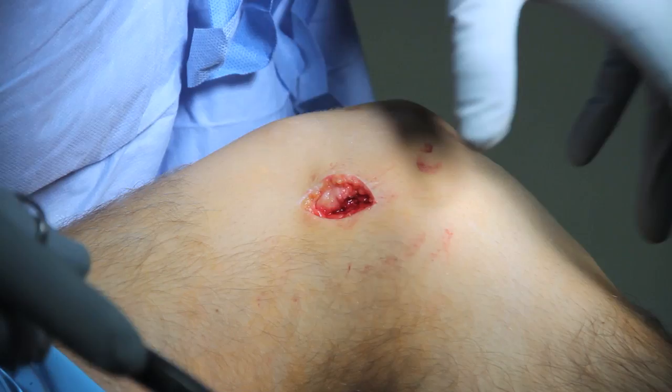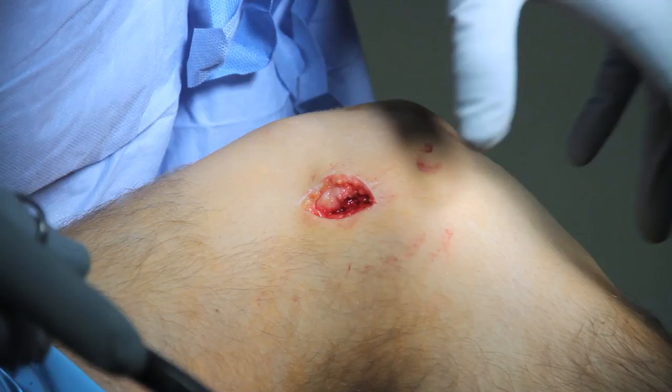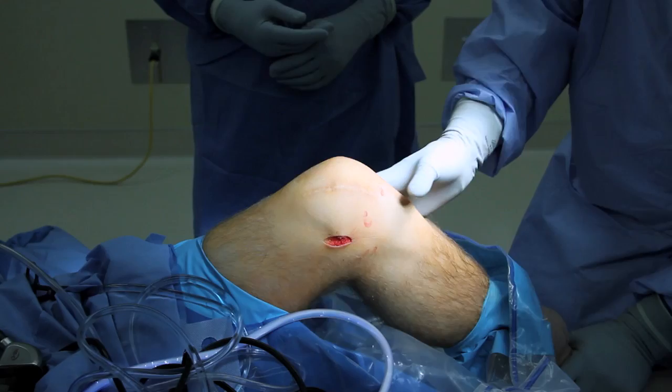Finally, the repair is over-sewn with a Vicryl stitch and the skin is closed. The entire incision is about 2.5 cm long in this case. A local anesthetic is administered around the incision site. The knee is examined and the kneecap is no longer unstable, and I can bend the knee through a full range of motion.